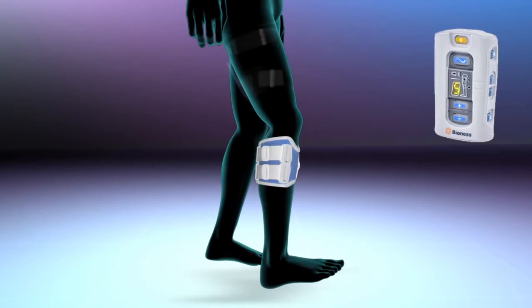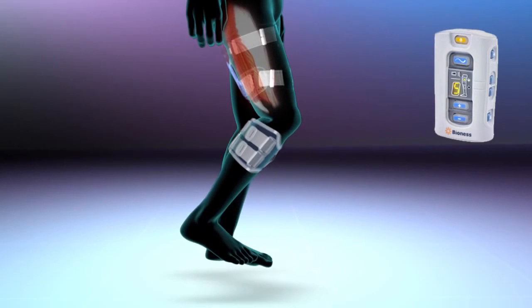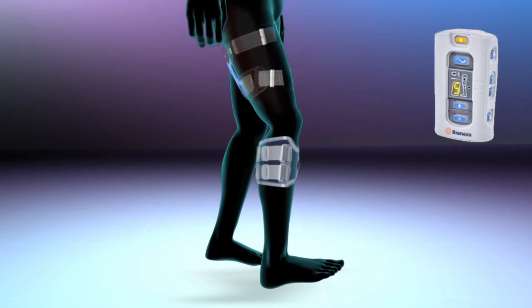The thigh cuff may also be worn on the back of the leg, stimulating the hamstring muscles that cause the knee to flex at the appropriate time during gait.